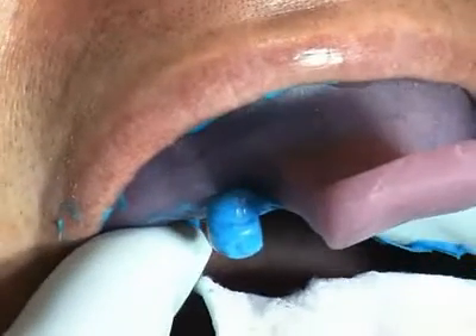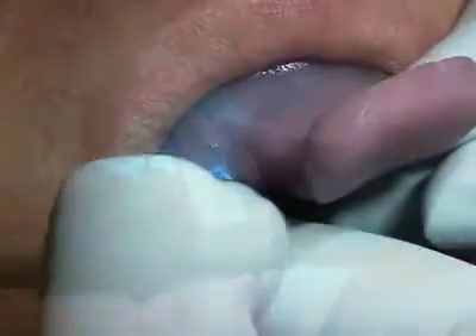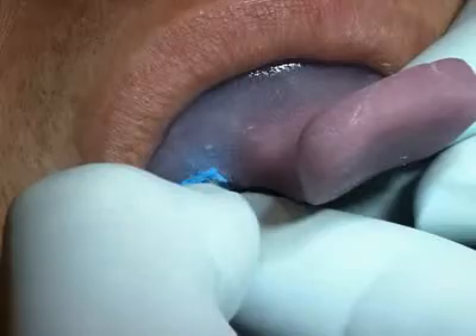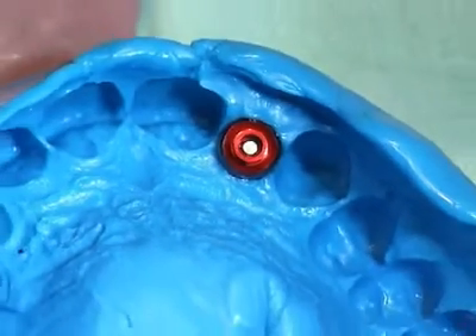The positioning screw is exposed before the impression material has completely hardened. The screw is then loosened completely to remove the impression. This is the completed impression with the impression coping.